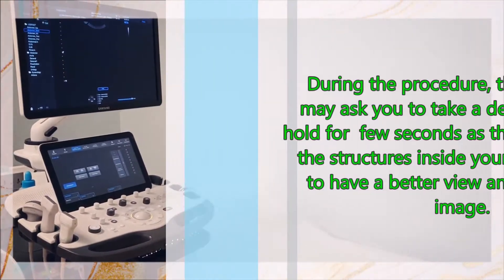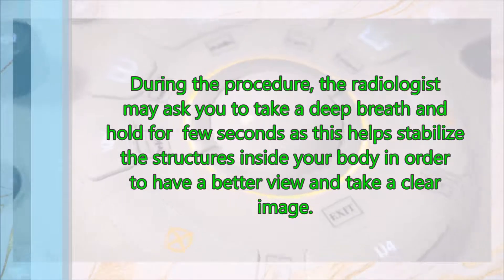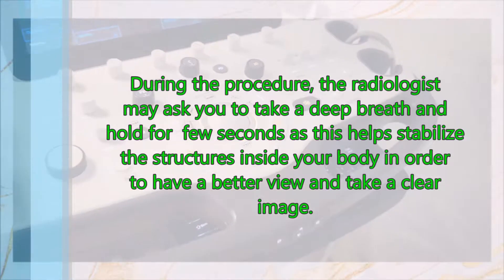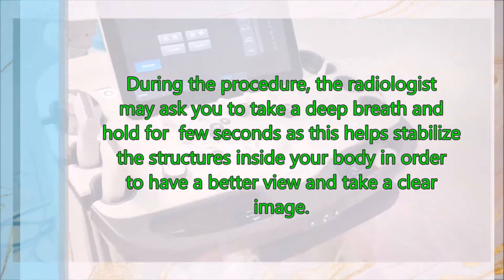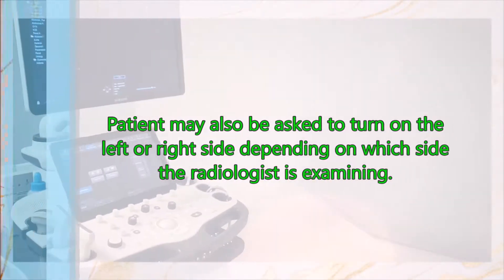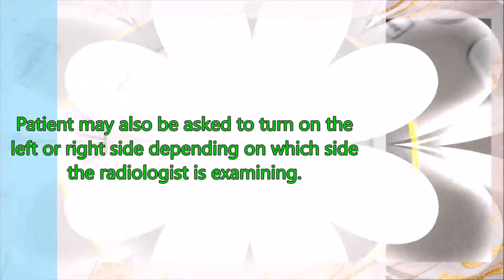During the procedure, the radiologist may ask you to take a deep breath and hold for a few seconds, as this helps stabilize the structures inside your body in order to have a better view and take a clear image. You may also be asked to turn on your left or right side depending on which side the radiologist is examining.